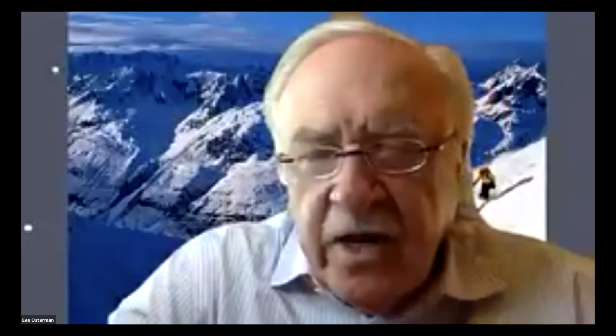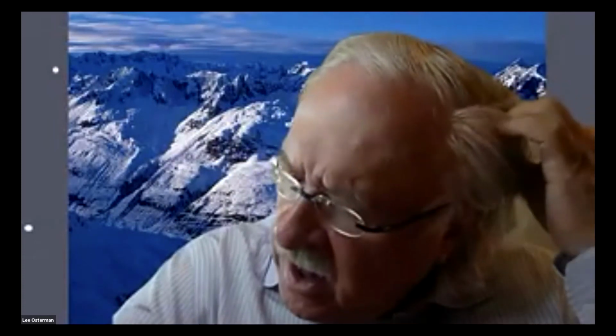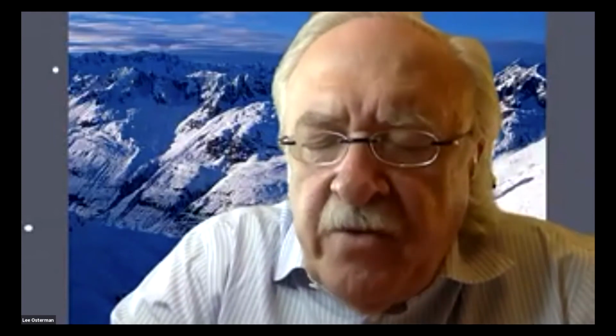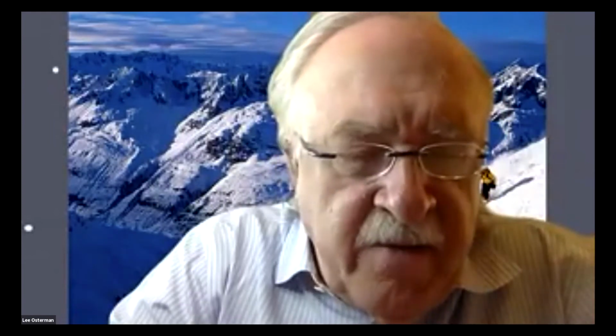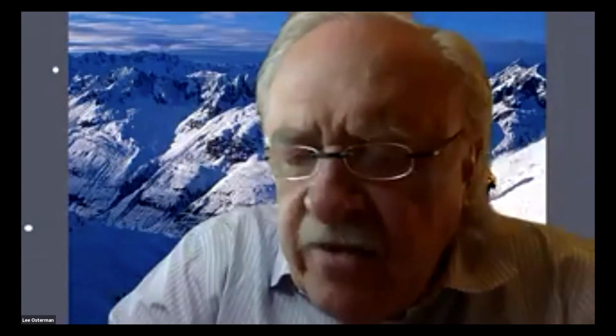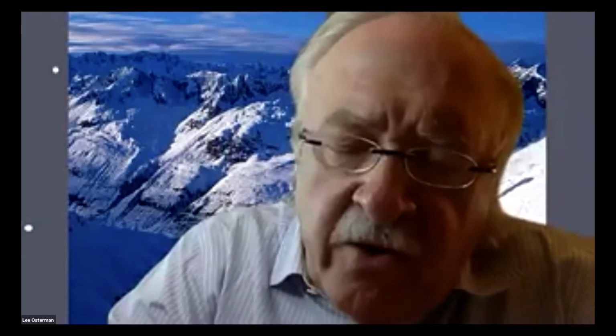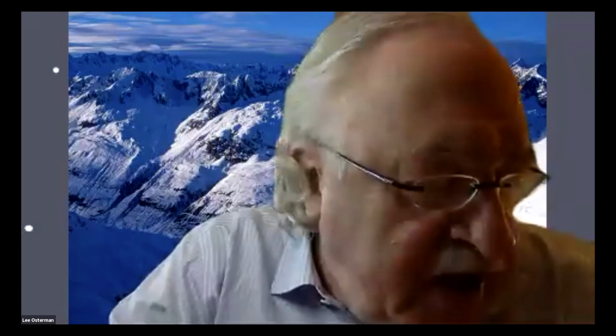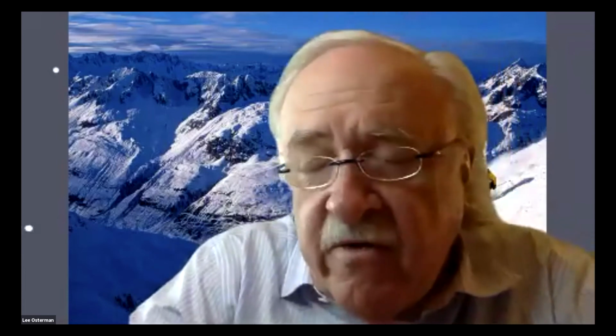Thanks, Will. I appreciate you covered a lot of material. One of the things that always has troubled me: we talk about wrist arthroscopy as the gold standard. But when we did a study a few years ago where we sent videos to people of your stature, we found the agreement rate was only about 80% between known arthroscopists of the wrist, and most of the differences were in the soft lesions, what you called your Geissler 1 and 2, the peripheral TFCs, whether they're really torn or lax. Do you find that there is a lot of variability in some of these lesions that we identify? Because we say the wrist hurts, there must be some reason, or do you think it just takes a lot more cases to get a sense of laxity under your belt?